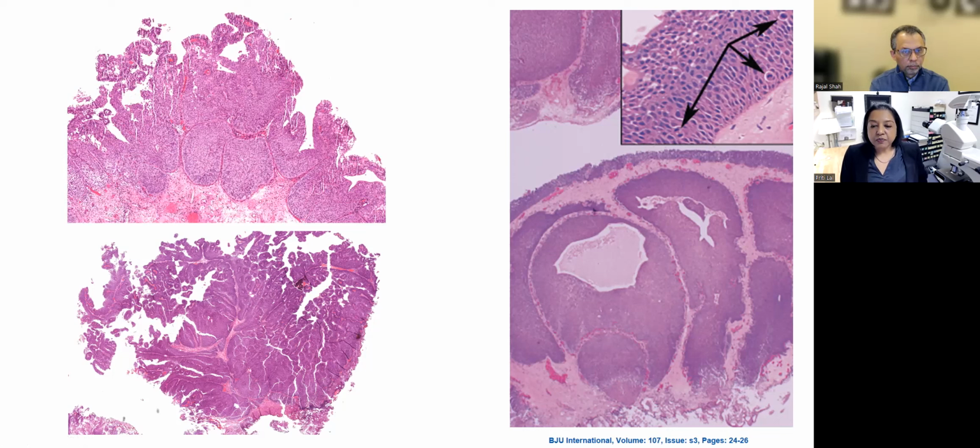The way to make sure that you are not missing a carcinoma is to look at the expansile growth of these inverted nests. Even though you can see some hint of basal layer here, these are really expansile growths into the lamina propria. And then you'll easily see cytologic atypia. You might see mitosis at various layers, and then from there, the diagnosis becomes easier.